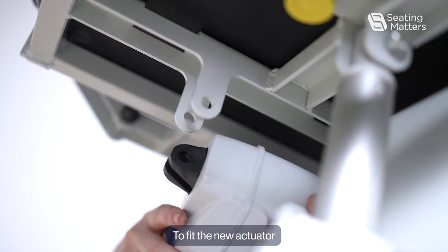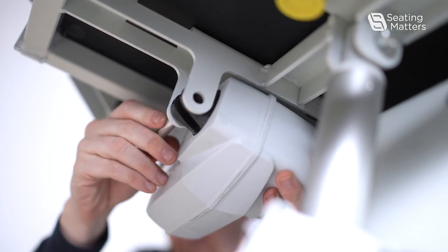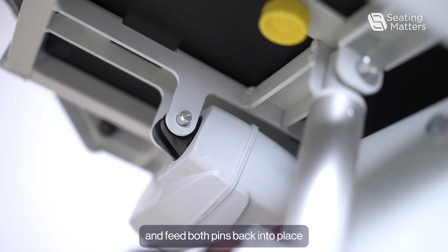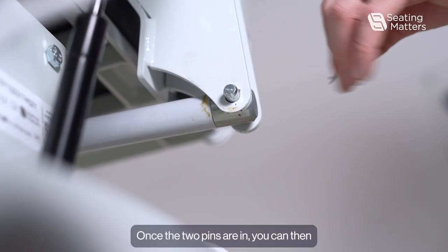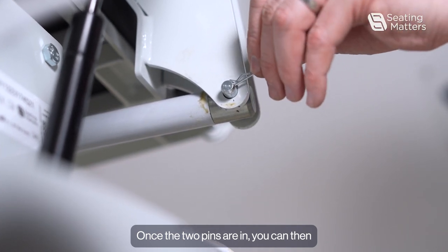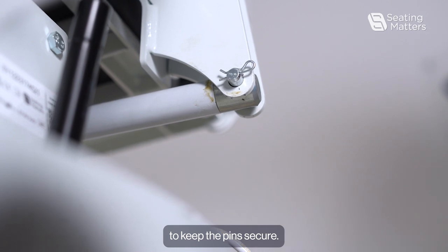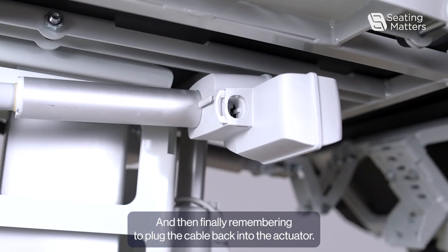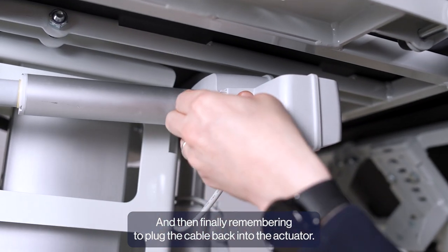To fit the new actuator, we just put it back in the same way that it came out and feed both pins back into place. Once the two pins are in, you can then put the arc clips back into place to keep the pin secure, and then finally remembering to plug the cable back into the actuator.